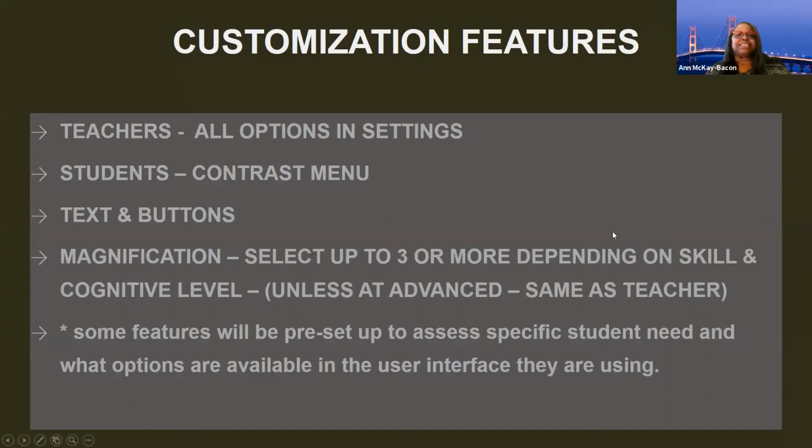All right, so the next step after we get it all set up and go over all the layout of it is customization. That's one of the things I like to do, not only with my teachers, but my students. With the teachers, this is where we go to the settings menu and go over all the options in the settings menu, and there are quite a few. So we spend a great deal of time talking about what options you would have for what particular student, trying them out, and going through each of those features.